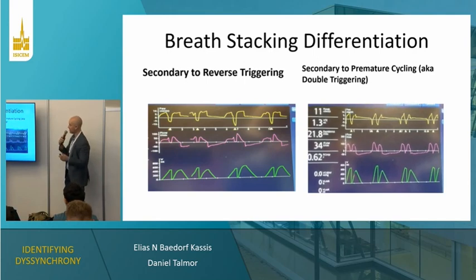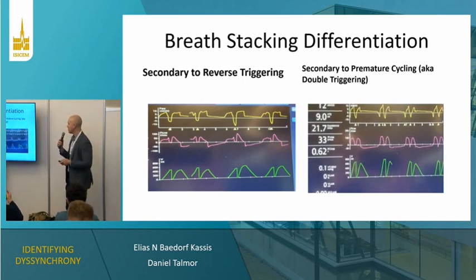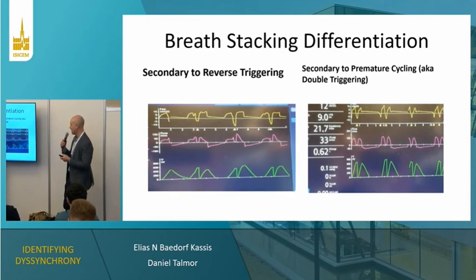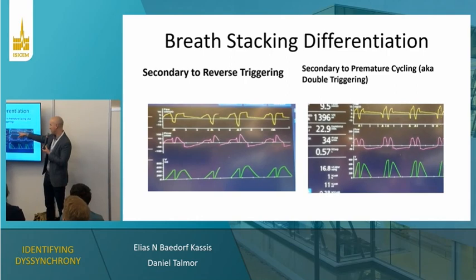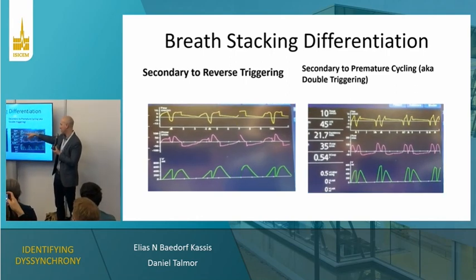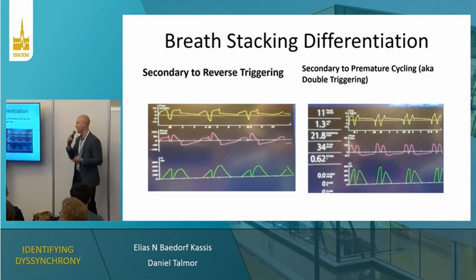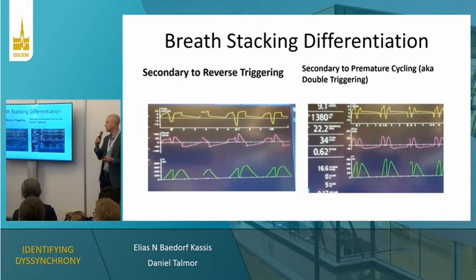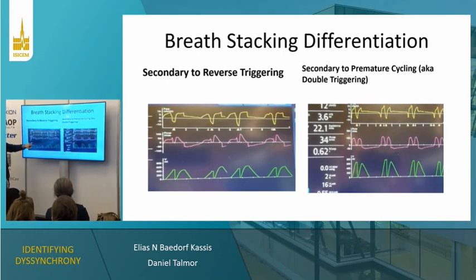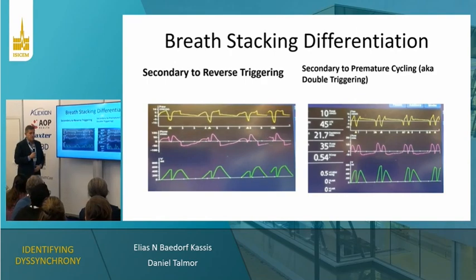Again, I apologize. It kind of just switched ahead on me for no reason. So here we can see the two side by side again to help differentiate. Here in the right panel the patient is triggering the breaths themselves, and on the left panel the ventilator is triggering the breaths. And notice that in both types you won't see the breath stacking on the volume curve because of that zeroing issue.